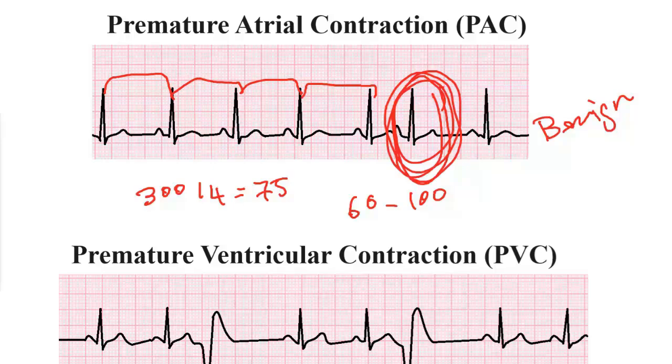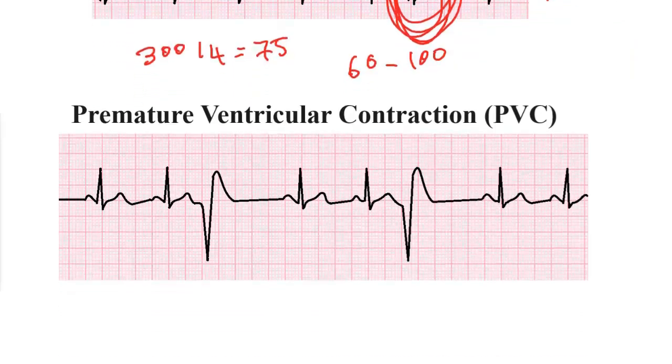And then the final one is the premature ventricular contraction, where due to the premature depolarization of the ventricle, there would be an extra heartbeat. This condition can also happen in normal individuals, and it's not dangerous, not to worry about it. Patients might describe it as their heart fluttering or having a skipped heartbeat. However, if we have this condition in some patients with cardiac anomaly, then that could be more dangerous.